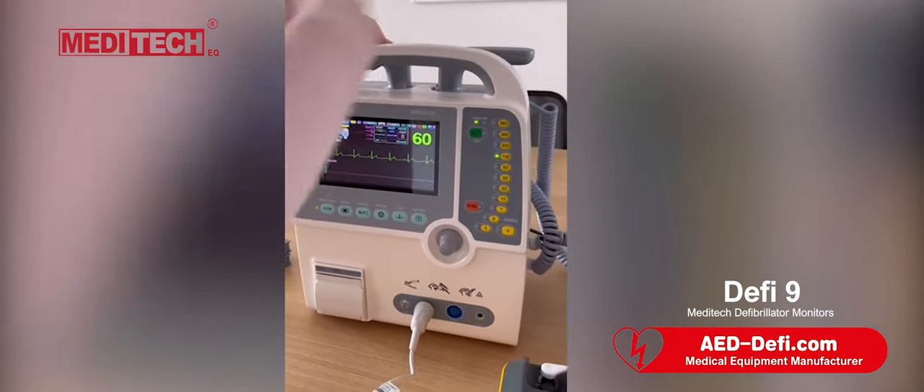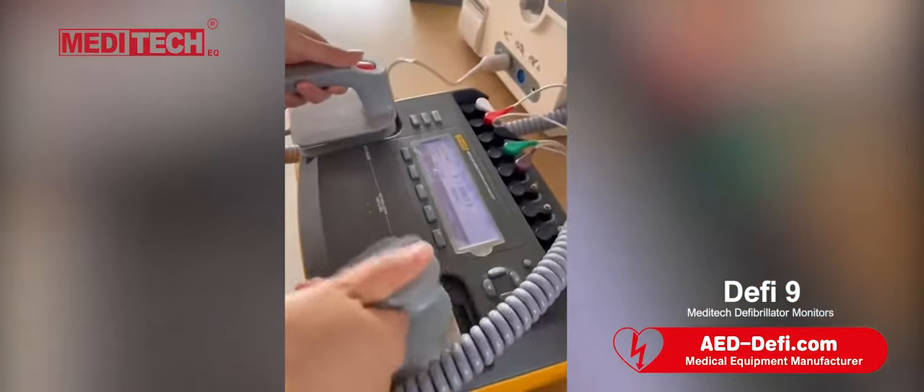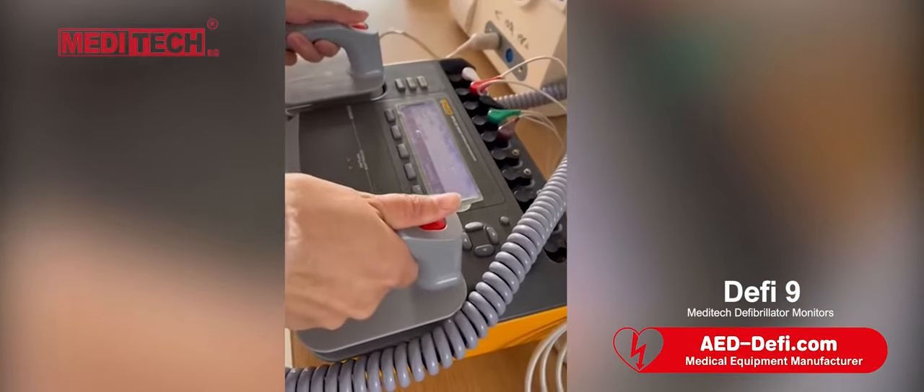Stand clear. Press shock. Let's do discharge. Press this button. Shock delivered.